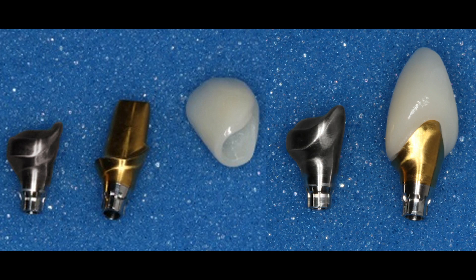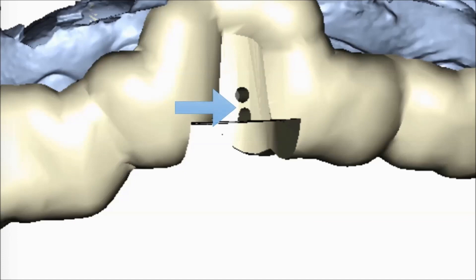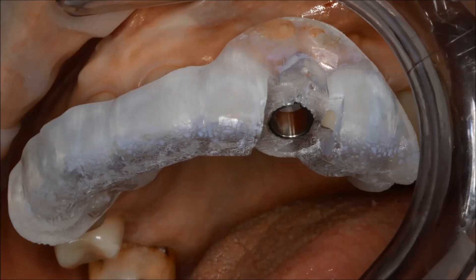We also have our printed model and our surgical guide. The indexing on the surgical guide is really critical for success of the case. In order to have prefabricated restorative components, we need to make sure the implant is placed exactly according to the plan — the vertical position and the rotational timing of the implant must be identical to how we planned it. The notching on the surgical guide is what ensures this happens. We'll be lining up that indexing with the implant driver, and once we do that, we'll know that our restorative components are going to fit. The surgical guides fit incredibly well — they normally cover about three-quarters of the arch and have a very nice snug fit, which is probably one of the reasons why the cases are so accurate.